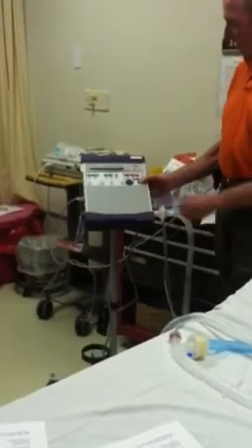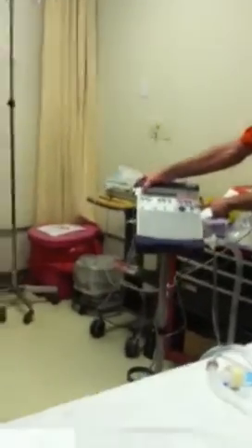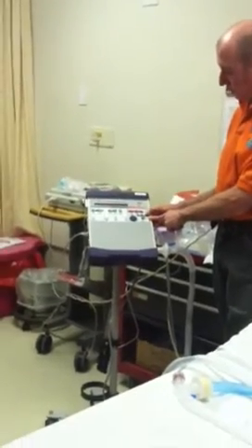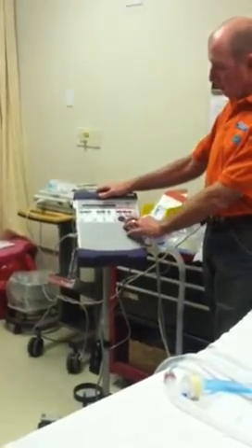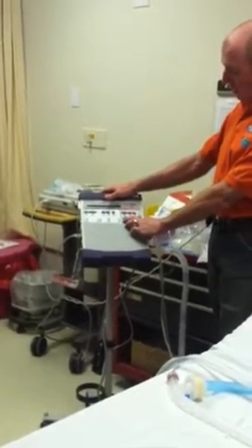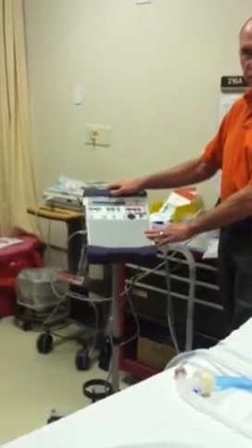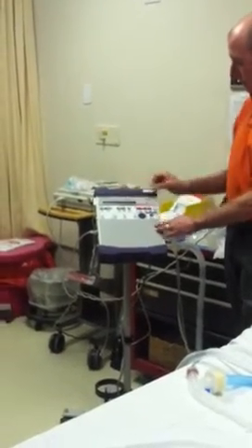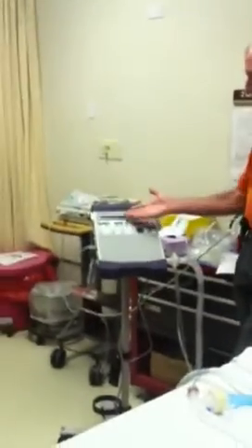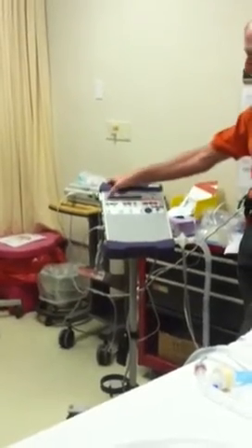And then that, like I said, okay, see, I hit the alarm silence button. Now I'm going to hit this, and it tells me it was high pressure. So the peak, the same way, I just hit it, and then I can lower it down to 5. Hit it again, but after about 3 seconds, it will go ahead and reset if you forget to hit the button. Now, if you come in and you hear the alarm, you're usually going to see whatever alarm's going, which is, in this case, our high pressure keeps going off.